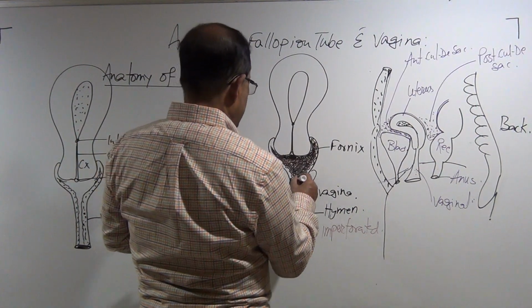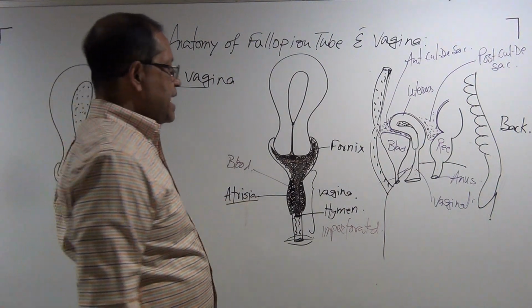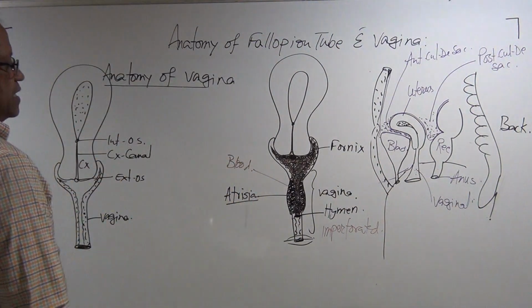Okay. Now look at here. It is getting more dilated. Sonographically, can I see this? Yes.